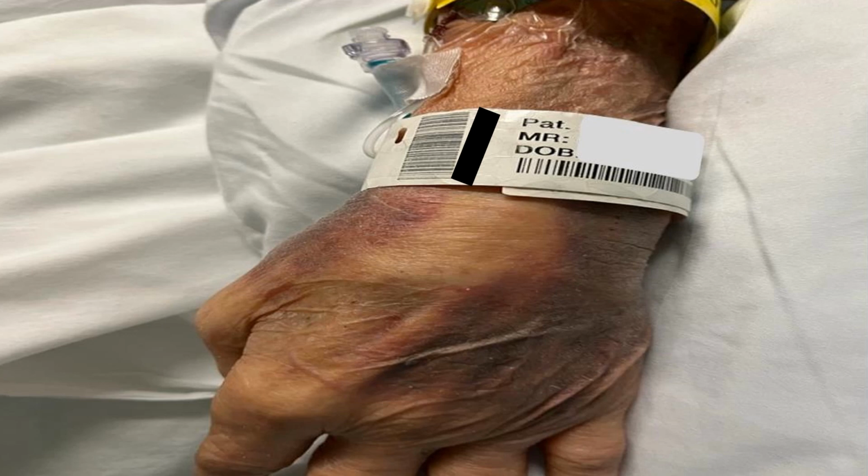Now, just as an introduction, let me show you what we normally go through in an ICU or in a hospital setting. Okay, I'm going to go a little fast. That means that a doctor will be using either a butterfly or regular needle in order to take blood work or the blood sample. Lo que significa esto es que nosotros normalmente vamos a estar tomando sangre en el área de cuidado intensivo, en pacientes con hematomas, en pacientes con edema. So we are showing here a patient with a hematoma and also edema and with many lines.